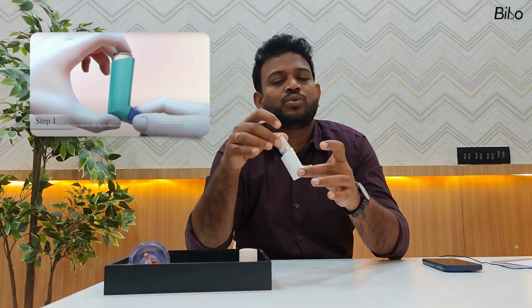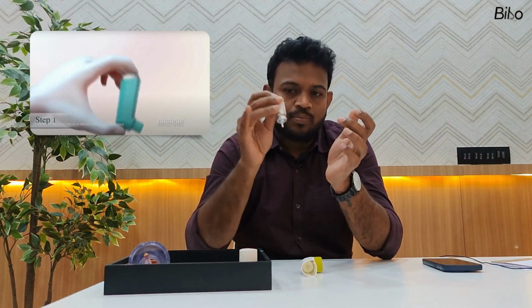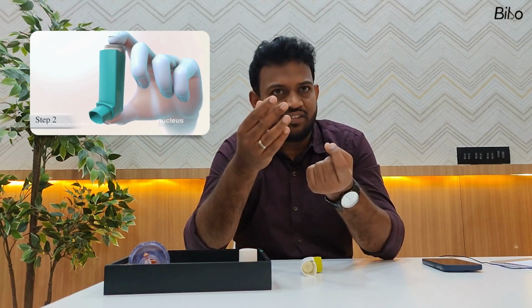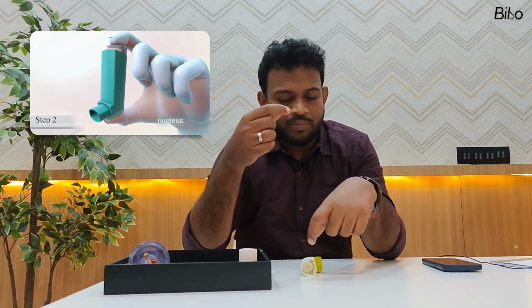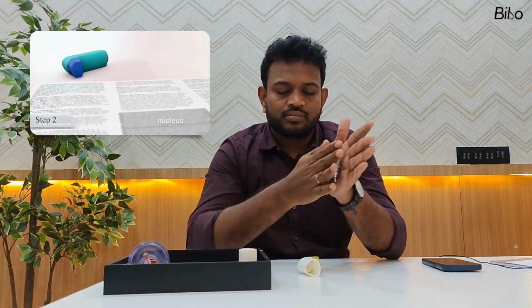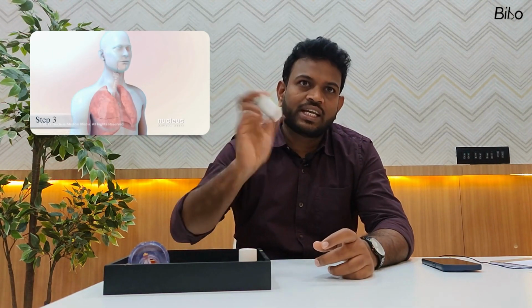First thing, we have to remove the canister from this, and then we have to warm the canister, because it has a medicine and then HFA, which is a propellant which will help the drug to be carried out and delivered into the airways. So we have to mix those two things. First thing is we have to warm the canister, then we have to place it back into the chamber, and then we have to shake it thoroughly.